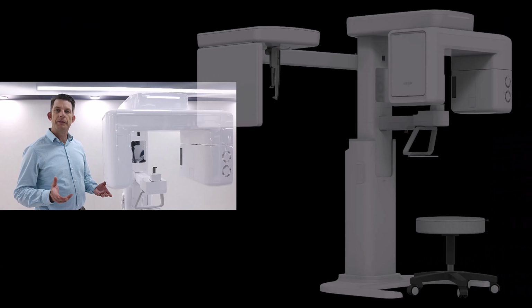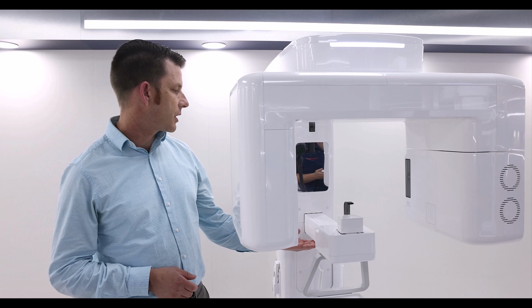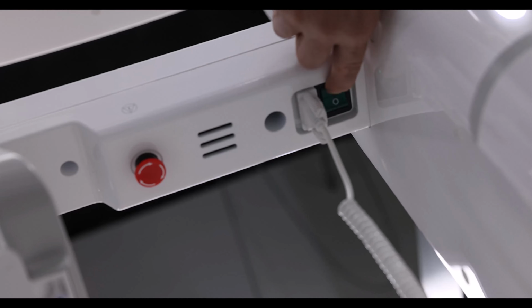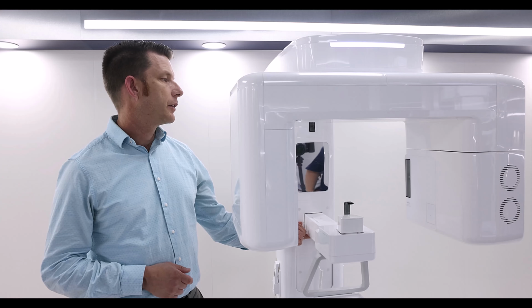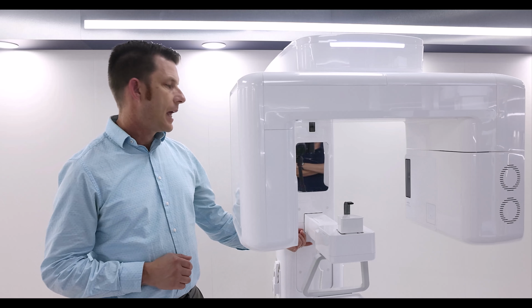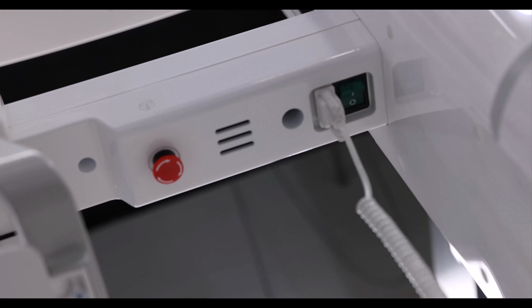This is a device overview for the Vatech A9. We're going to start with the on-off switch, which is underneath the horizontal column. It's a green toggle switch. You want to toggle this on in the morning. You'll notice that the overhead will go into a start rotation. And in the evening, you want to go ahead and toggle it off to power the machine down.